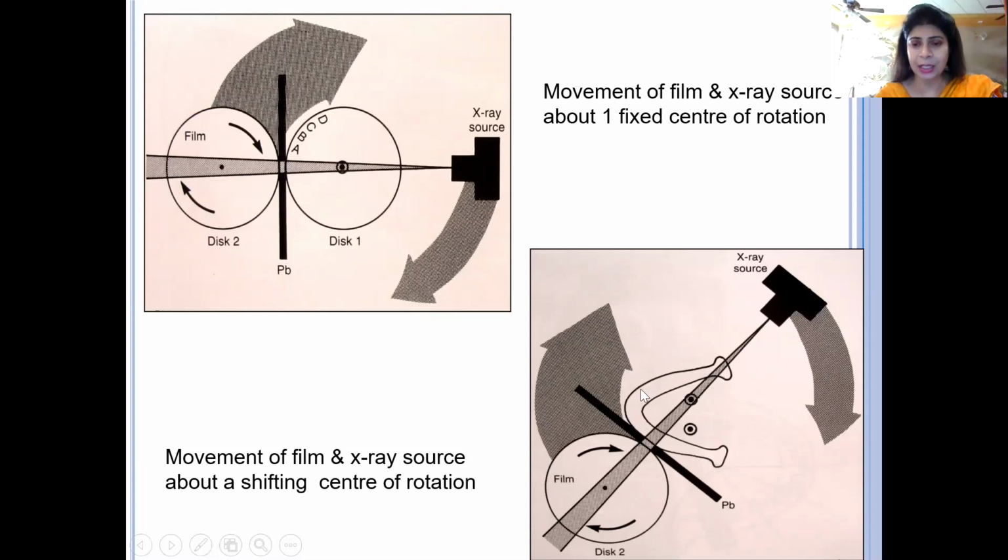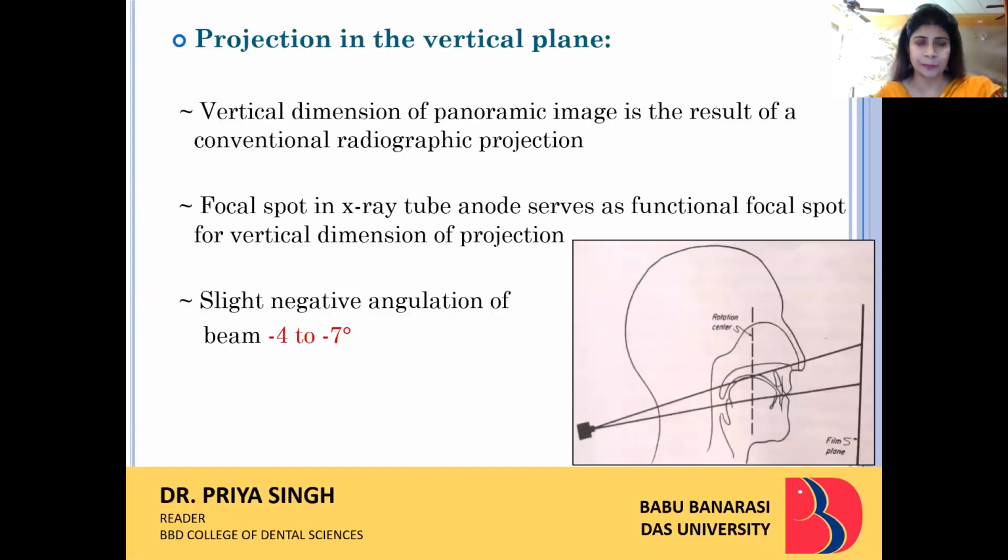Here you can see the mandible of the patient with various centers of rotation. And the same thing is happening now. The X-ray source and the image receptor move in opposite directions but at the same speed, whereas the patient is stabilized and, at multiple centers of rotation, the X-ray is cast and images are taken in sections. Tomo images, which are combined to form a single regular image.